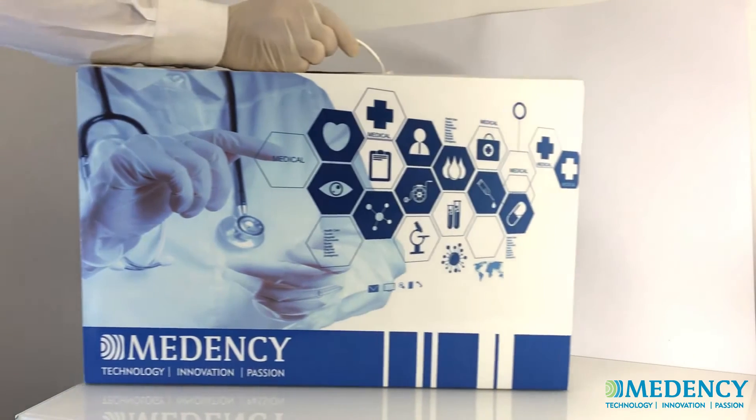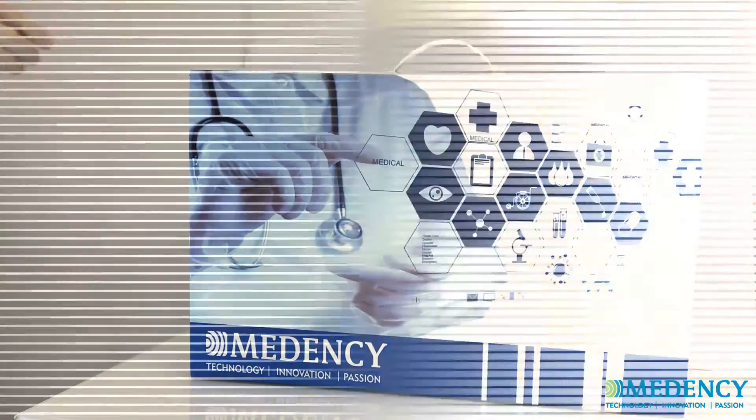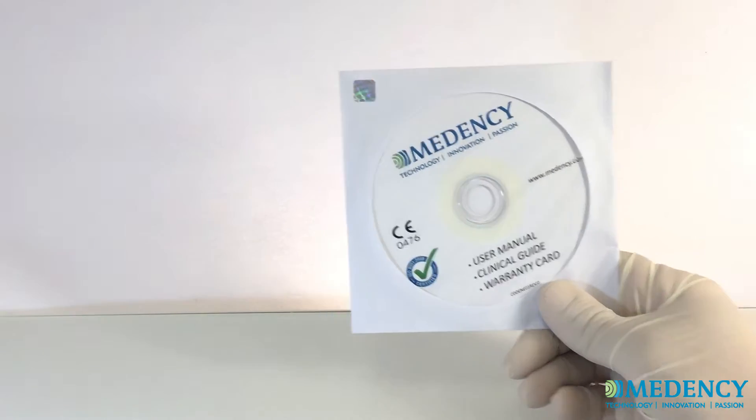The Primo device is delivered inside a convenient carry case for easy transportation. The package contains the starting kit with important information related to your Primo system. Be sure to review all items carefully prior to first use.